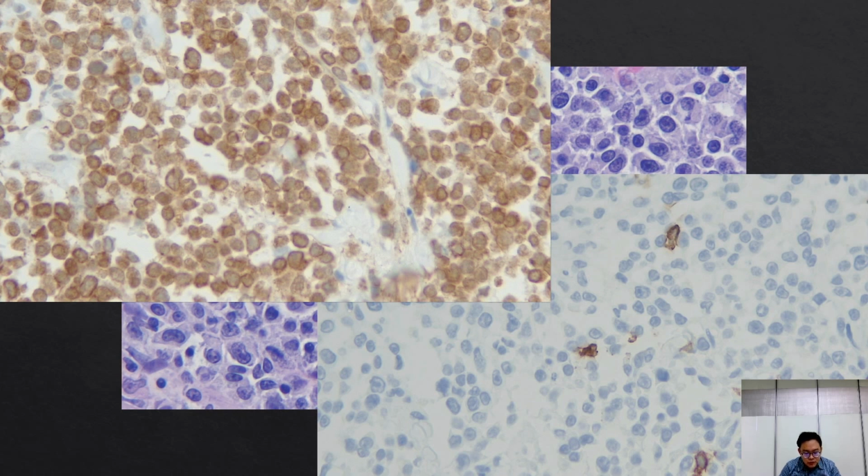We will do this for all sorts of things. Sometimes when we get sarcomas in the gastrointestinal tract, you can't determine just based on our view of the HE stain what type of sarcoma it is. And sometimes the clinicians will elect to do additional IHC stains to determine what the cell of origin is in these sarcomas, because it could make a difference for how they are going to treat the patient.